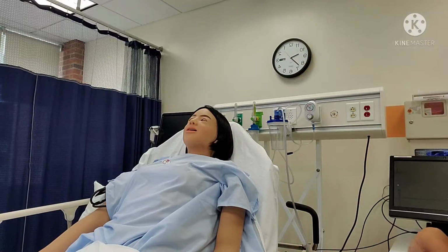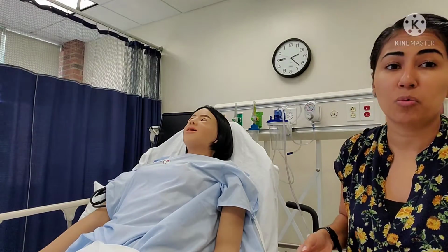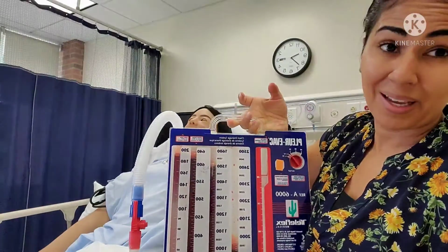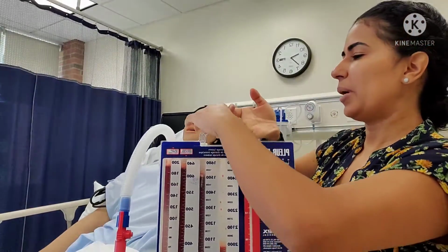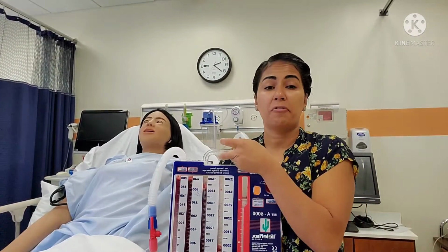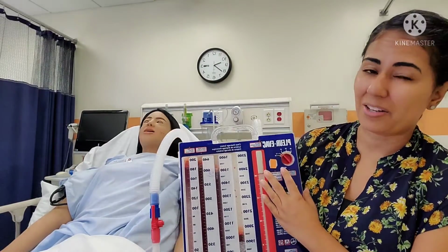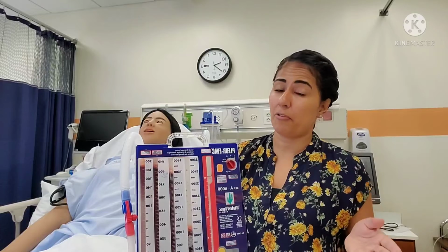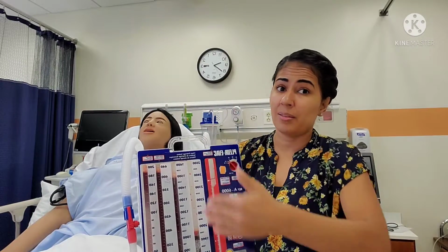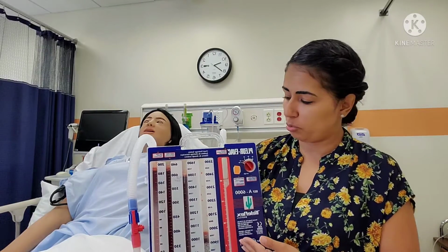So I'm going to want to look at my suction canister. Now, in the real world, I would never pick this up, but for the sake of teaching today, I'm going to pick it up so I can save my knees, okay? So after I've assessed that my patient looks comfortable, their vitals are all good, the dressing is good, and the tubing is secure, I look at my canister. Now this takes only about a few minutes, okay? So it's not like I'm coming 10 minutes later to look at this. Within this little assessment, within 5 minutes, I'm already assessing this chest tube drainage system.